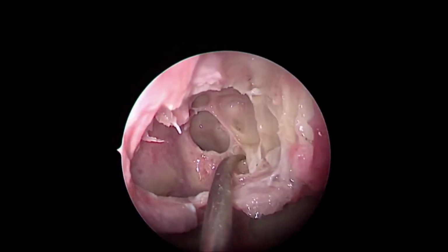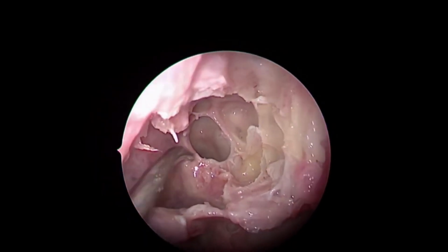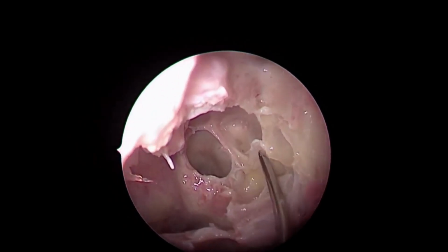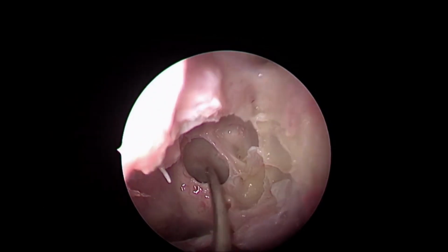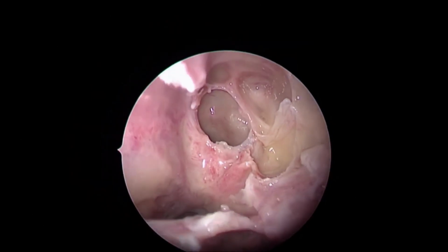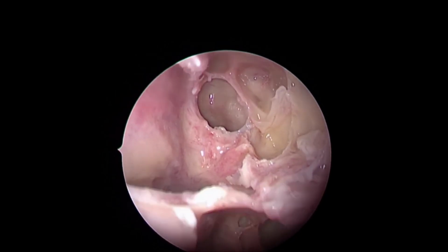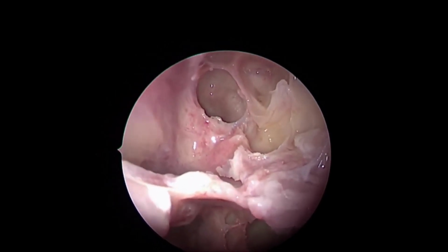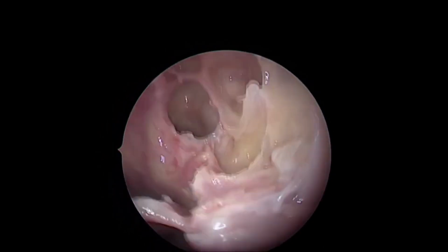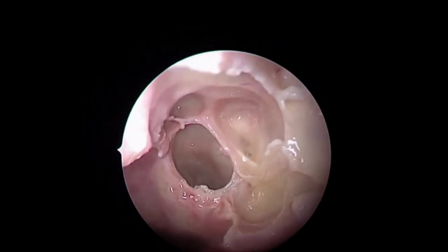The bottom line is, while doing post-ethmoidectomy work, you have to stay extra careful. Go to the medial side, look at the sphenoid sinus, make it the posterior limit of posterior ethmoidectomy, define that, and then go for a sphenoidotomy and widening the sphenoid to carry out a safe sinus surgery. Remember the words from Mosher 100 years back: the easiest way to kill a person is posterior ethmoidectomy. If you do it carelessly, you can easily injure the internal carotid artery. There are a lot of reports published where people have done it.